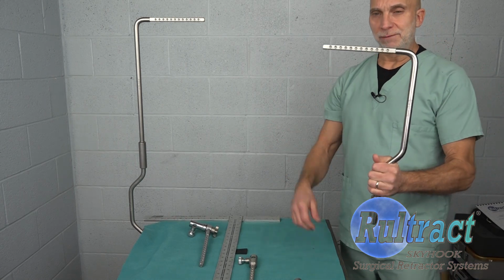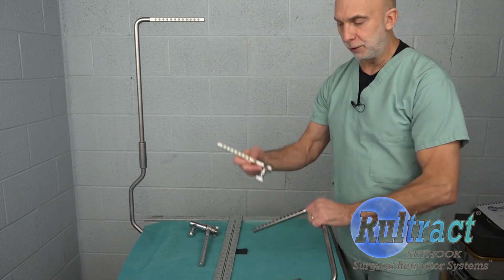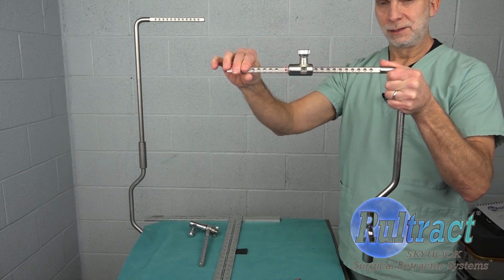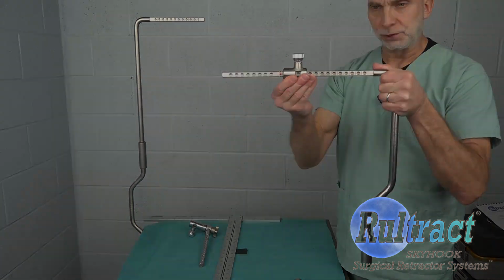If you do not have detents on the bottom, you have to make certain that you're putting your extender bar on with the tightening knob on the top. Once you do that, your extender bar has detents on all four sides.